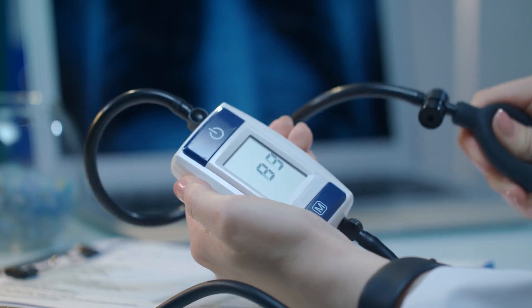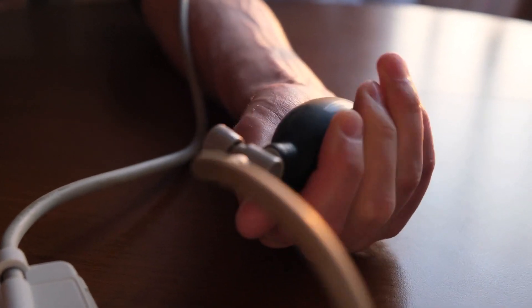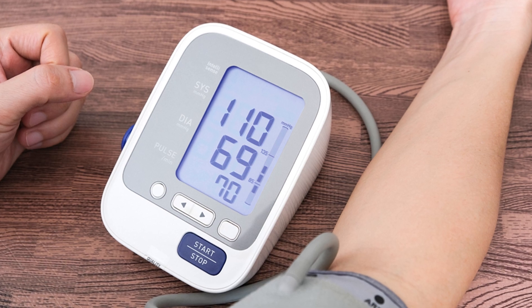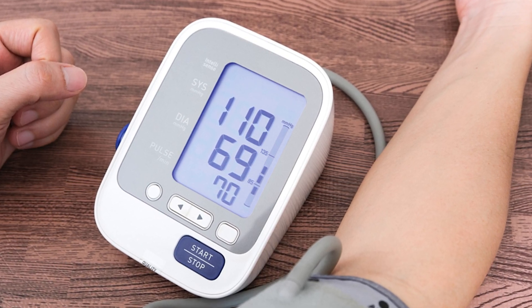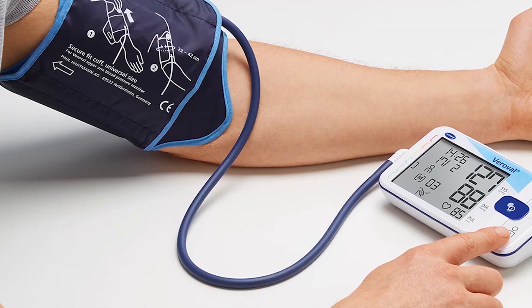Blood pressure monitors allow patients to take their blood pressure at home without the assistance of a nurse or other medical professional. They feature a digital screen that gives a readout of your systolic and diastolic blood pressure, as well as your pulse per minute. The screen either attaches to the arm via a tube or can be strapped directly to the wrist.